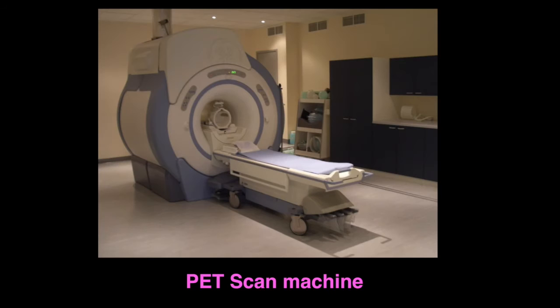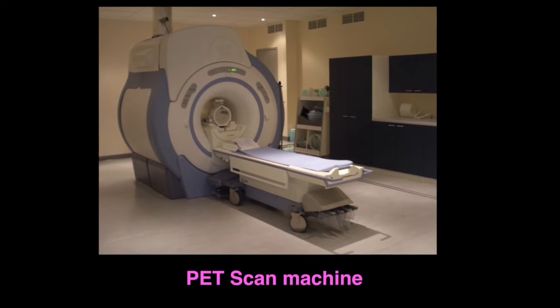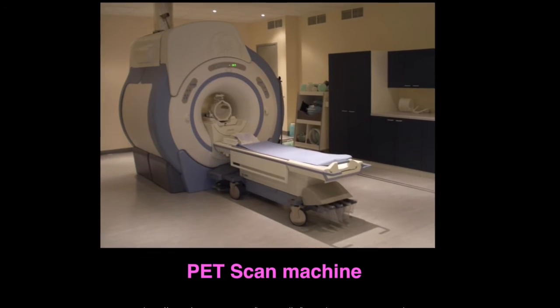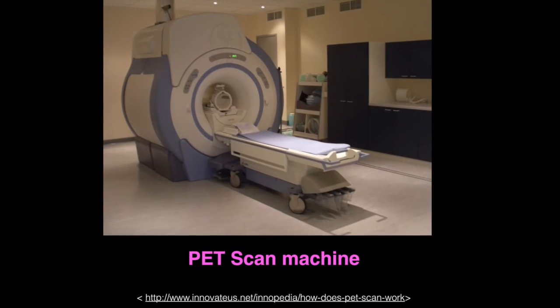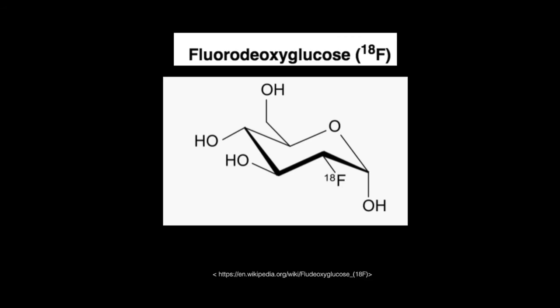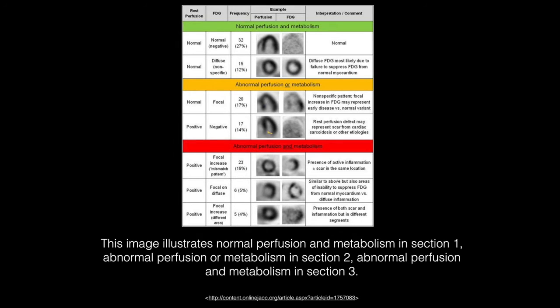and an MRI. So a cardiac PET scan is a non-invasive diagnostic test which evaluates the flow of blood to the heart. During the test, a small amount of radioactive tracer is administered as well as a radioisotope with a natural body compound. The radioactive tracer used is fluorodeoxyglucose, FDG, which combines the natural glucose in the body with fluorine-18. This radiopharmaceutical is used in CAD detection as it measures the body's metabolic reaction to FDG. In cases where there is disease, or the heart muscle is damaged, the impaired metabolic action will be present, which you can now see in this image shown on the screen.